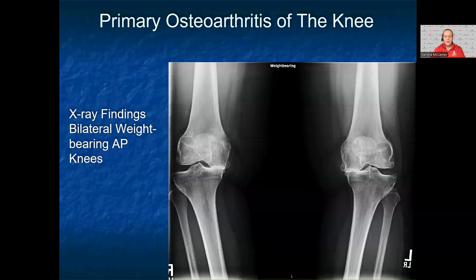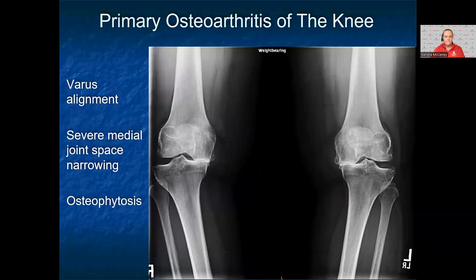The patient's bilateral weight-bearing x-rays are shown here. On this x-ray, the patient has varus alignment of the knees bilaterally. He has severe medial joint space narrowing bilaterally, sclerosis in the medial joint line bilaterally, and osteophytes in the bilateral medial and lateral joint lines. This is consistent with knee osteoarthritis.